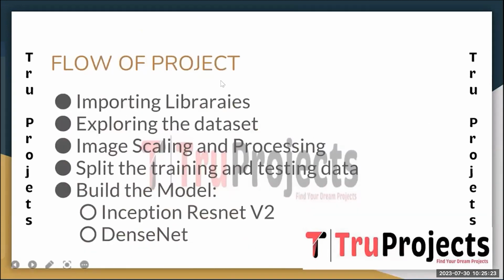And to know about the flow of the project, these are the steps we need to discuss. The first one is importing the libraries. In this step, we import the necessary Python libraries and frameworks required for the deep learning project. These include TensorFlow and PyTorch for implementing the neural network, an image processing library for handling the fundus images, Flask for creating the web interface, and other essential libraries for data manipulation and visualization.